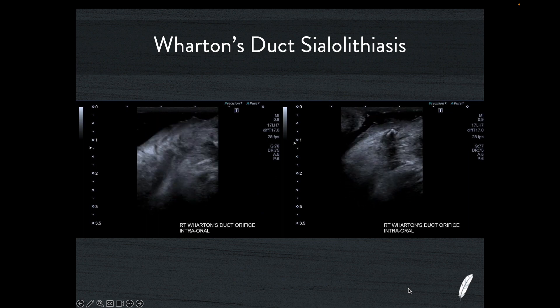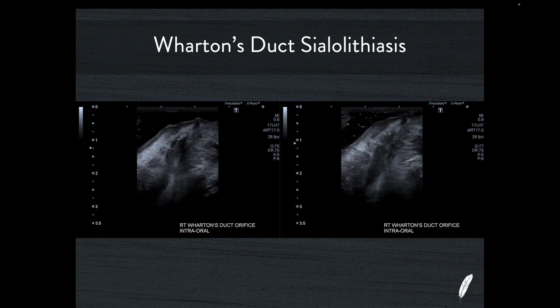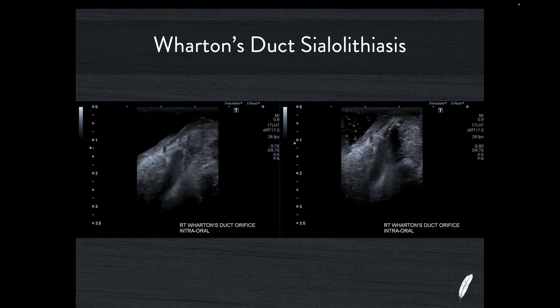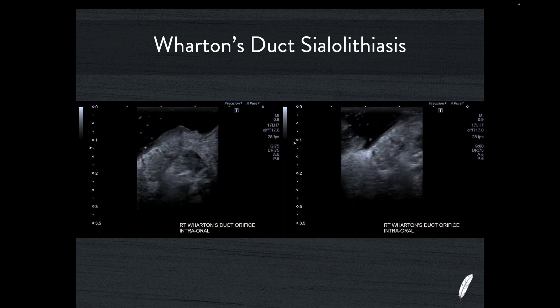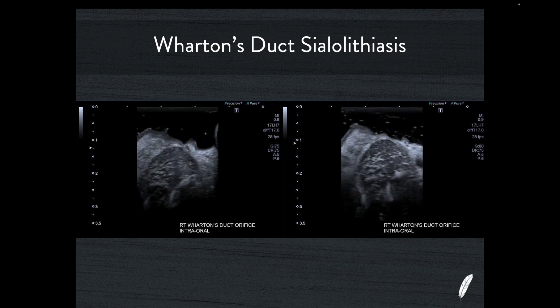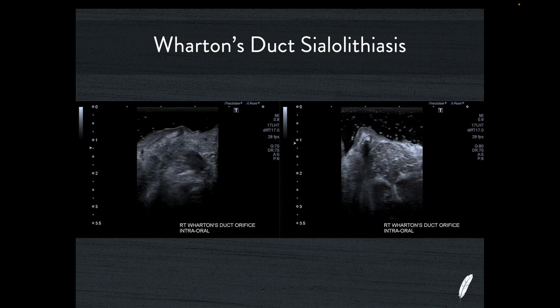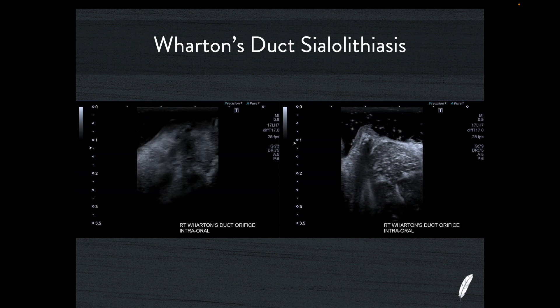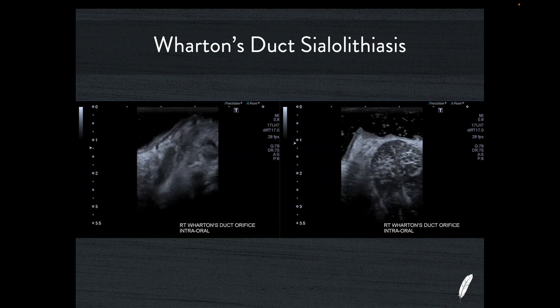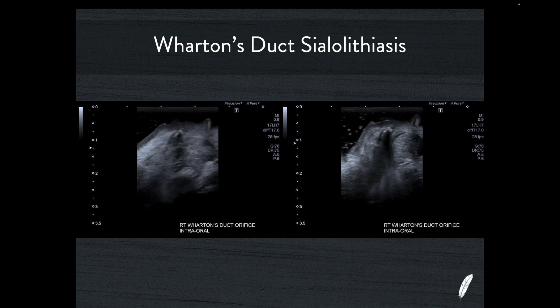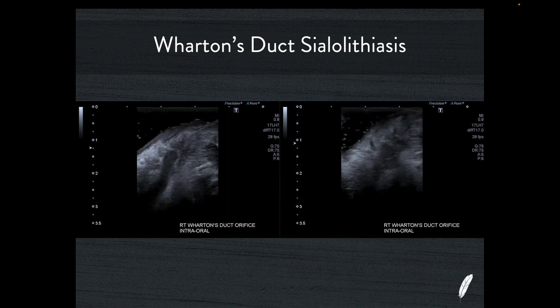Using an intraoral approach can be very fruitful in these patients. The moment I've got unexplained sialectasis of a submandibular gland and I've chased it as far as I can to the oral cavity using the submental approach, I'm going to go inside the mouth with the transducer and get the answer I'm looking for.